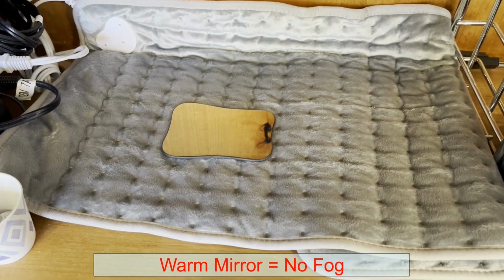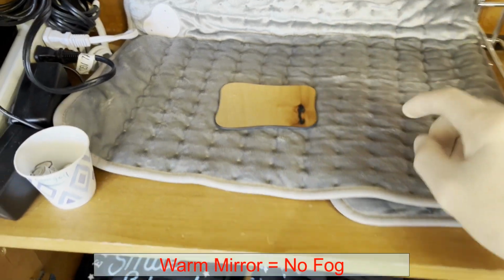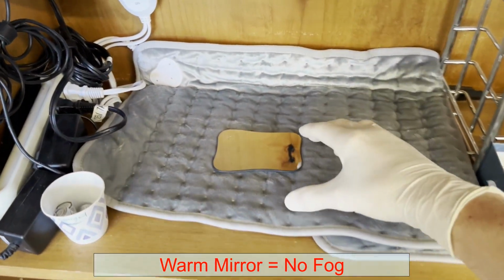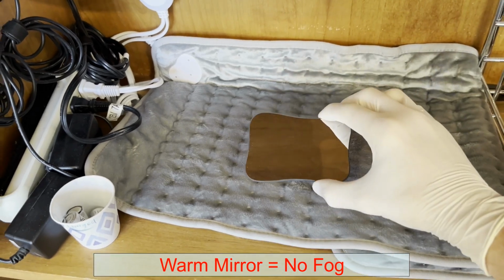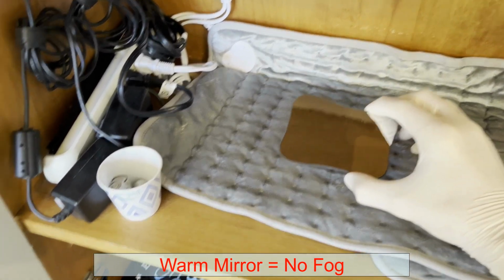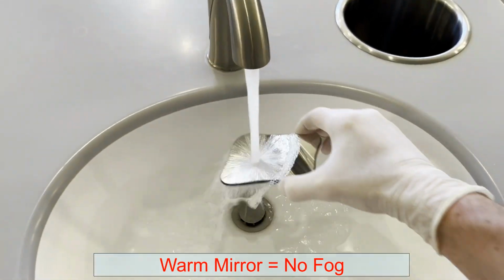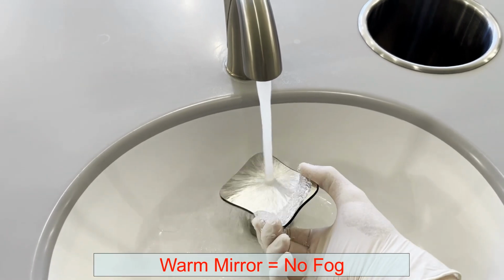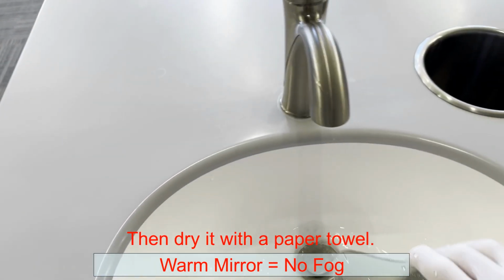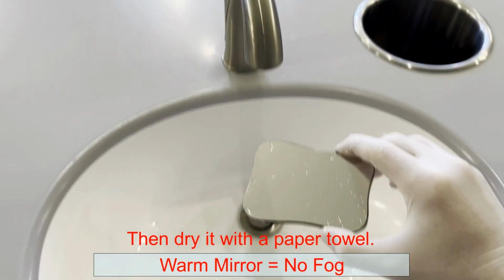You want the mirror that you're using to be warm so that it doesn't fog up in the patient's mouth. So you get it right off of the heating pad and you use it first. That's why I take my occlusal shots first, so that this is warm and does not fog up. If it gets cooled off, you can run it under some hot water for a while to heat it back up, and that will prevent your mirror from fogging up while you're taking photos.